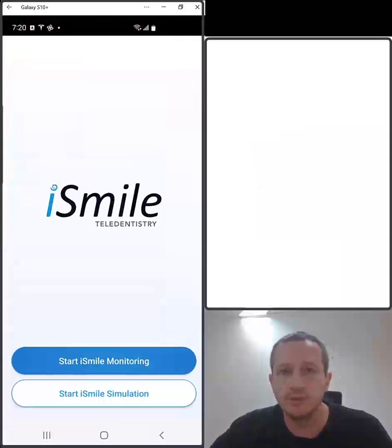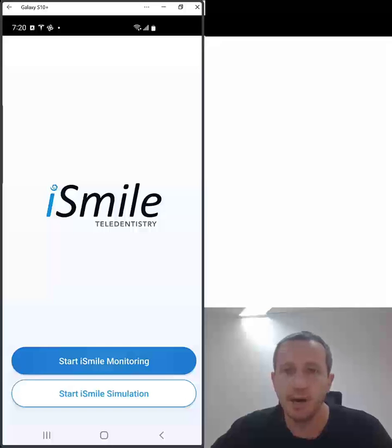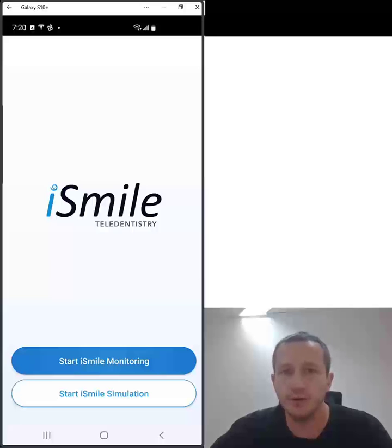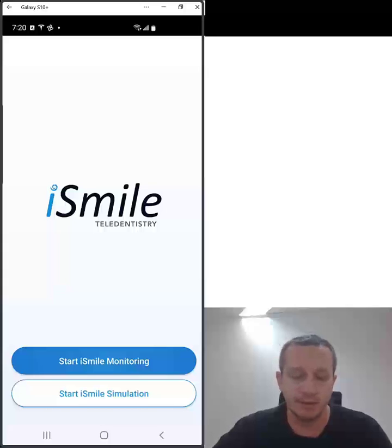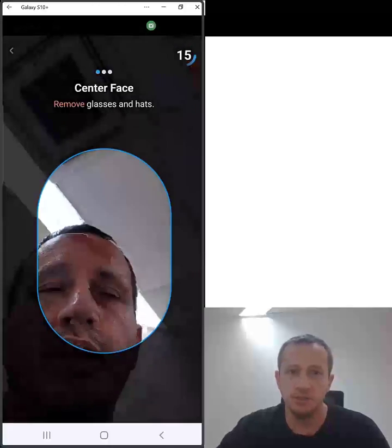We see there are two options on the screen. The first option is to start iSmile monitoring — that is remote patient monitoring for after a dental treatment. Your dentist can request photos and scans of your teeth to follow up on your treatment, and that should be used only in conjunction and coordination with your dentist.